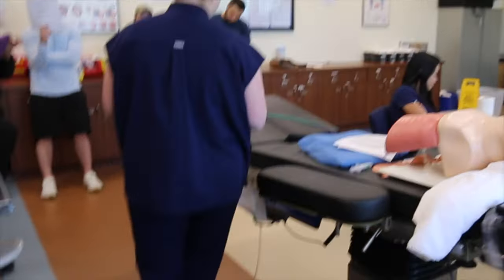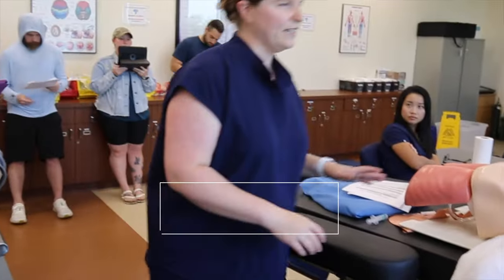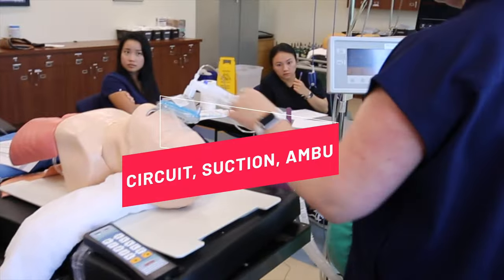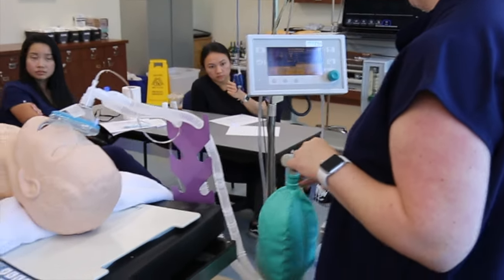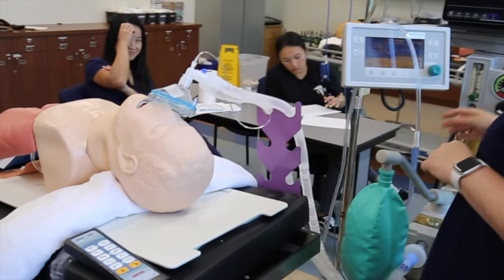All right. So this is me doing the exam. All right, coming in. Circuit, suction, and Ambu bag. So I have my face mask, my two-limb circuit with HMEs. I've got my end-tidal CO2 connected to the Y piece and the DISS with my reservoir bag. I have working suction. And then I have an Ambu bag over here.